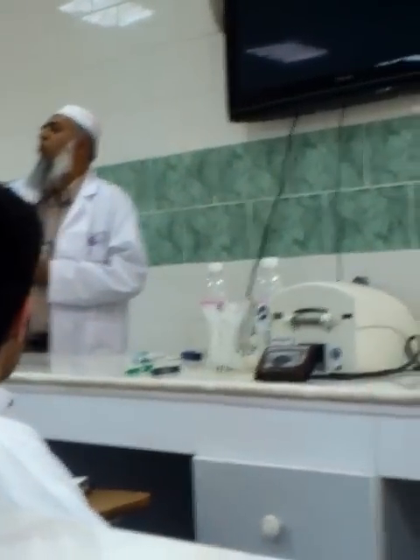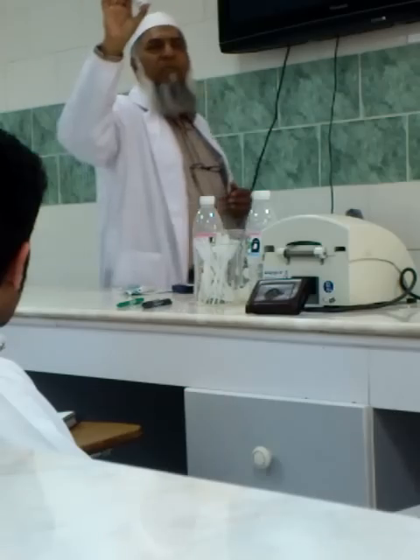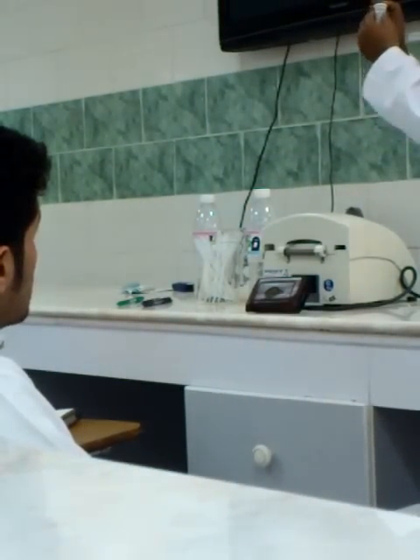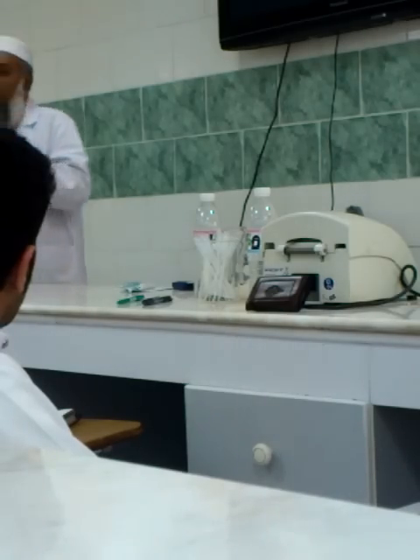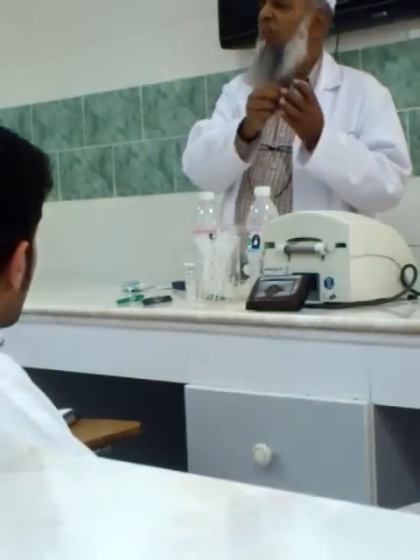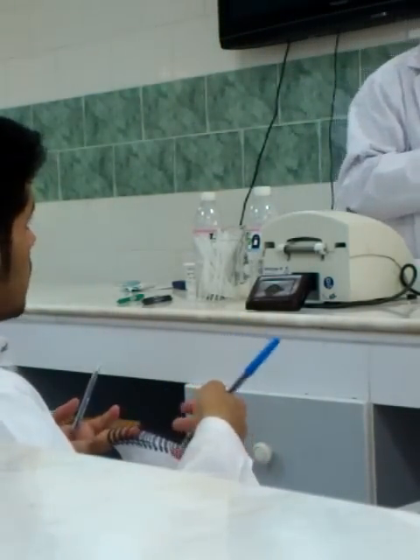This coding chip is available whenever you purchase the box of glucose strips. With every glucose strips box, a specific coding chip having information about these glucose strips is available in the bottle. So you have to open the bottle, take out the coding chip, put it inside here, and then you can introduce your glucose strips.